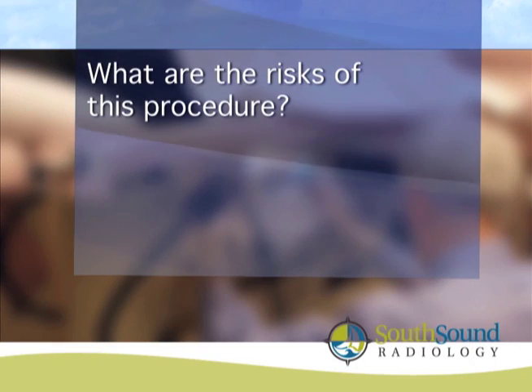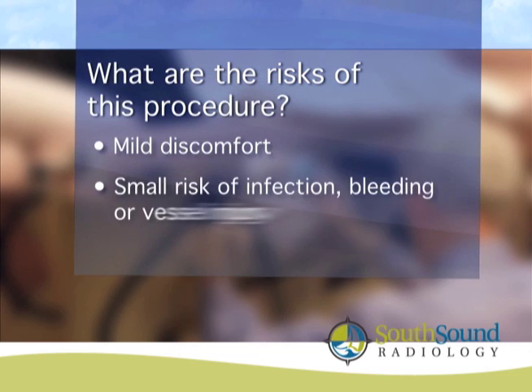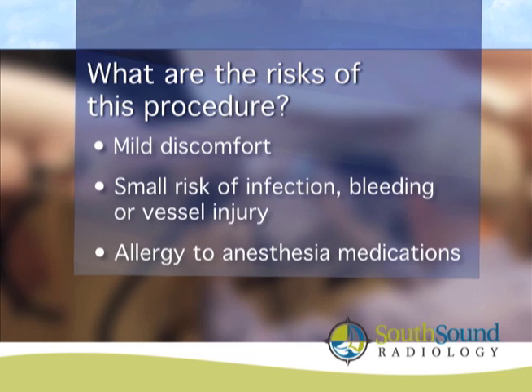Most patients only experience mild discomfort during the breast biopsy. Occasionally, some patients experience a moment of pain, and may require additional numbing medication. Because we are breaking the skin's barrier, there are minor risks, including, but not limited to, infection, bleeding, vessel injury, or allergic reactions to the medications used.